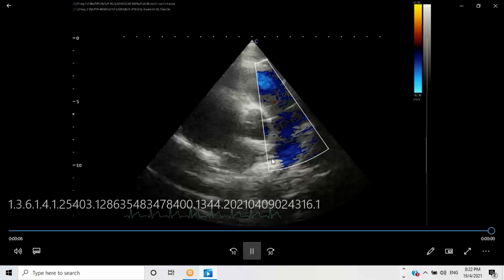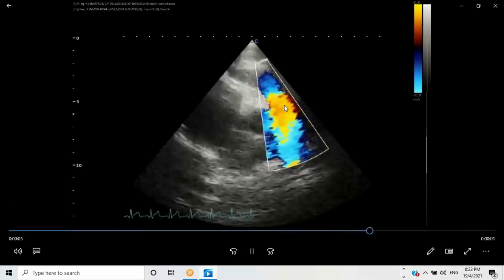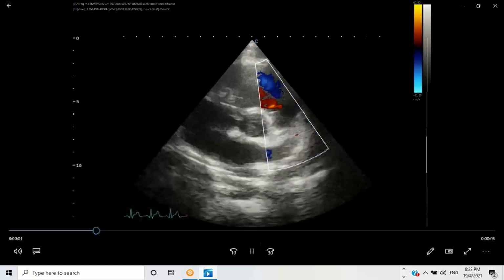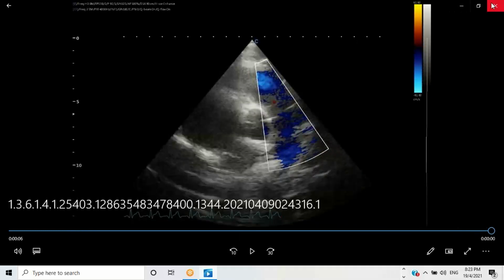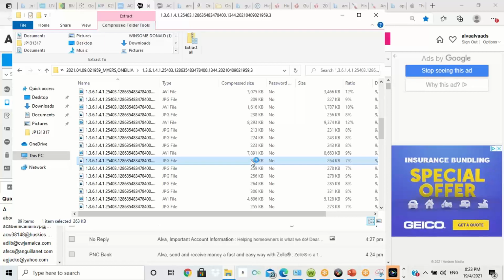So you have to look for it, and it's red because it's pulmonic insufficiency. Pulmonic insufficiency is blood flow from the pulmonary trunk across the pulmonary valve into the right ventricle. Okay. So you use your color to assess qualitatively, and then you can quantitatively do additional Doppler assessment.